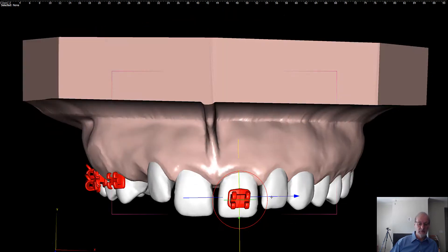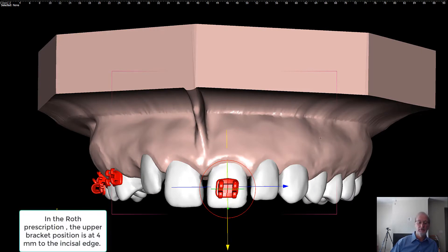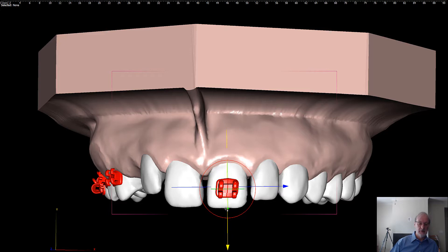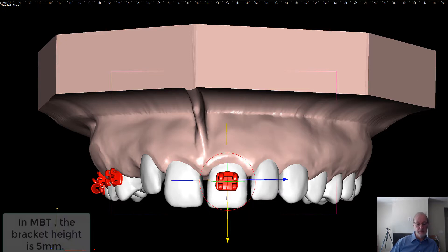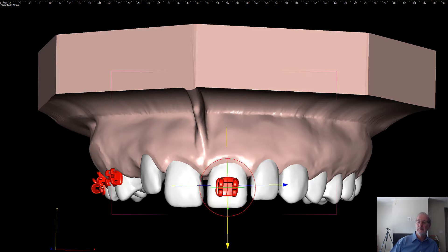In the Roth prescription system, the upper bracket has to be positioned at four millimeters — meaning the center of the slot to the incisal edge is four millimeters. In the MBT or other prescriptions, the height of the slot to the incisal edge will be slightly different — in this case, five millimeters. You can appreciate the difference between that positioning and the conventional Roth positioning. It doesn't really matter which one you use; you have to fit the height required by the prescription.